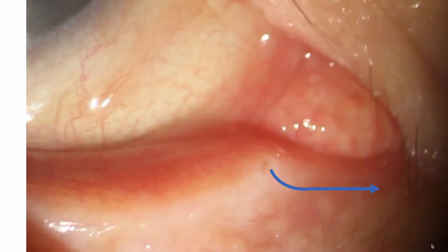I want to demonstrate here that the lacrimal canaliculus can take different shapes. You can see here I've got a vertical orientation and then there's almost a right angle turn to the canaliculus. Some people will have a more obtuse angle and some people will even have a curved type appearance to their nasolacrimal system. The way you can overcome these differences is by putting lateral traction on the lower eyelid to pull it out laterally, and that straightens up the nasolacrimal system so there's a nice smooth curve — no oblique angles — to allow insertion of a dissolving or temporary punctal plug.